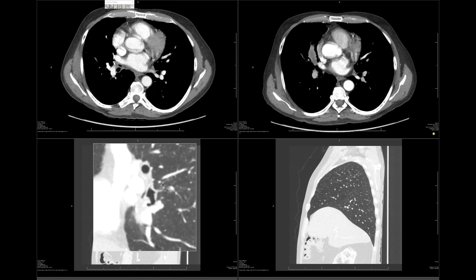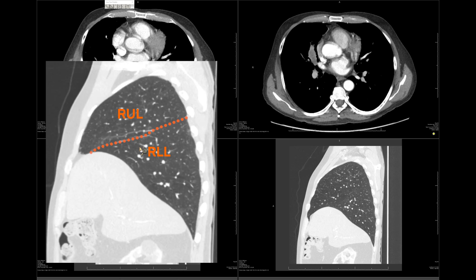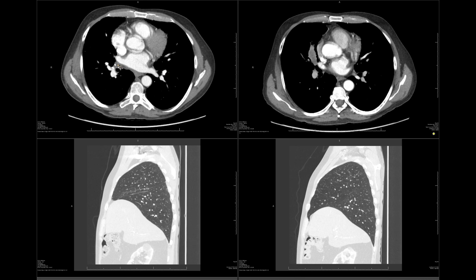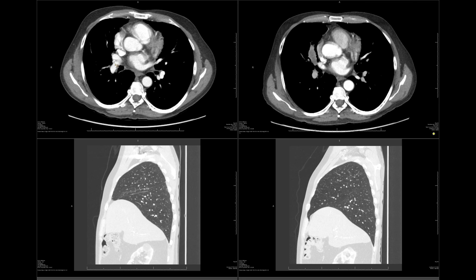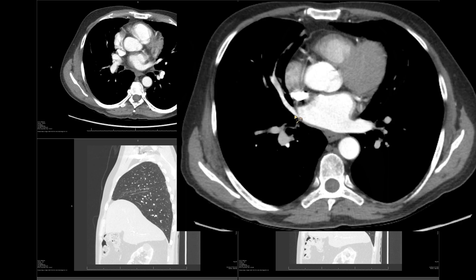On the sagittal images, this anterior bronchus is the right middle lobe bronchial stump, which just comes to a point. Based on the position of the fissure, the upper lobe has expanded down and the right lower lobe has expanded anteriorly to fill the relatively small space once occupied by the right middle lobe. Usually two arteries supply the right middle lobe arising from the right interlobar artery, but in this case only one could be identified. As for veins, the right middle lobe typically gets venous drainage from the right superior pulmonary vein, but in this case drainage was from its own right middle pulmonary vein.